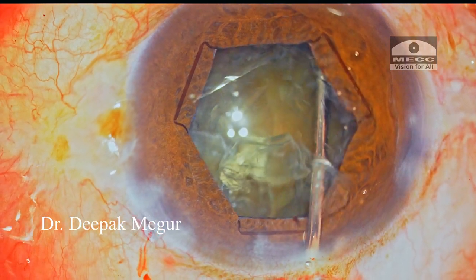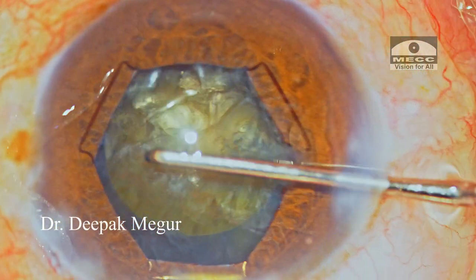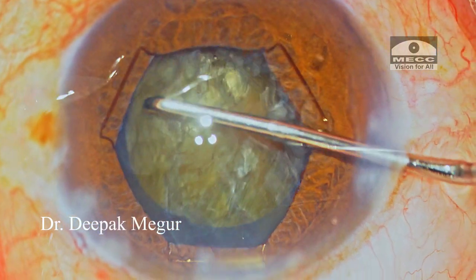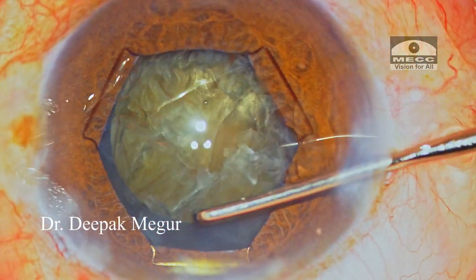I repeat hydrodissection and rotate the nucleus using a sharp chopper — pushing the nucleus down vertically and then rotating it. I can clearly see now that the cortex-nuclear complex is free from its attachment to the bag, because as I'm rotating the nucleus, the bag remains still.